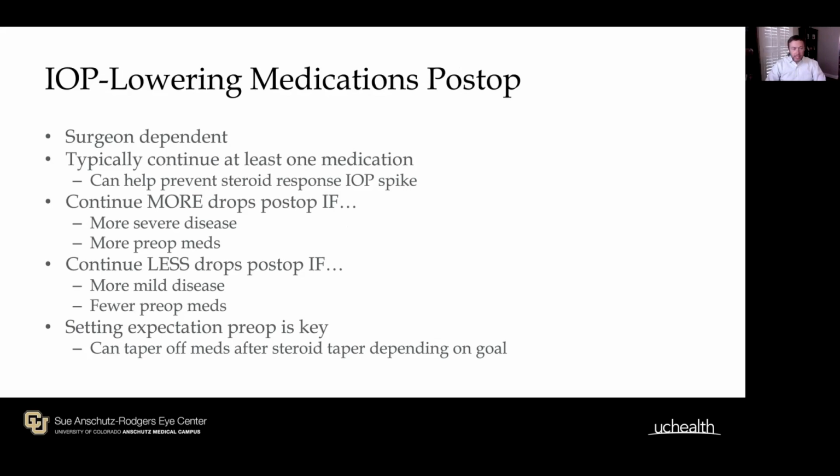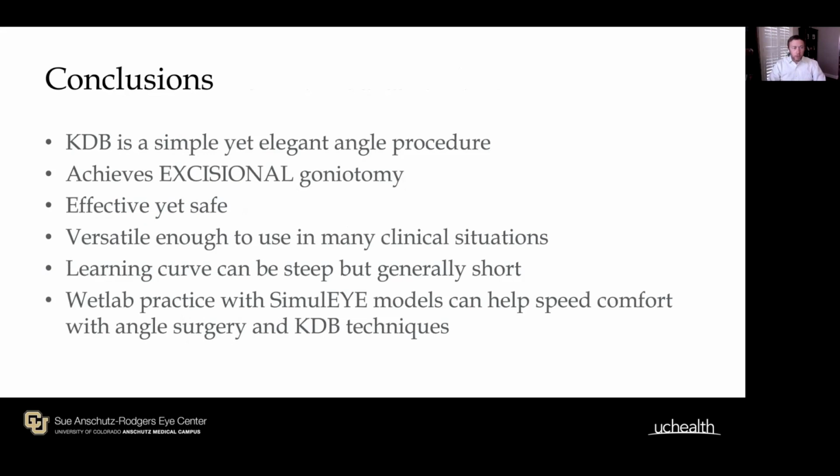But setting expectation is key, and remembering that you can always taper off the glaucoma meds after the steroids have been tapered. So in conclusion, KDB is a simple yet elegant angle procedure which achieves excisional goniotomy. It's effective yet safe and versatile enough to use in many clinical situations. The learning curve, like any new procedure, can sometimes be steep, but it's generally short. And wet lab practice before your first cases with the simulated models can really help speed your comfort and learning the different techniques of the KDB.